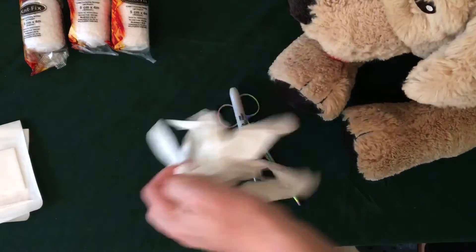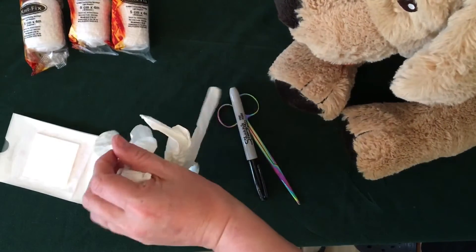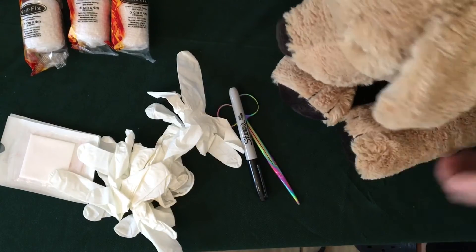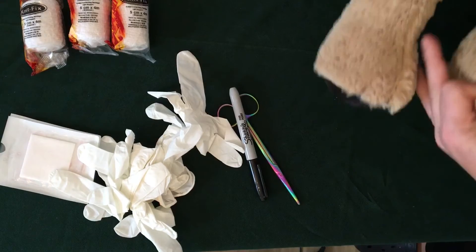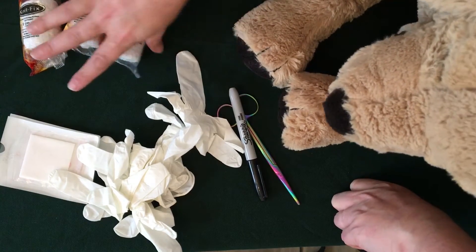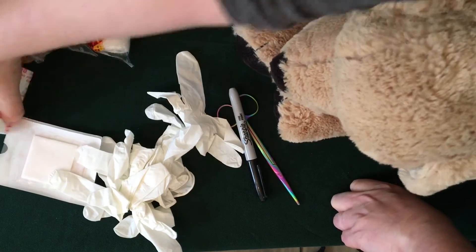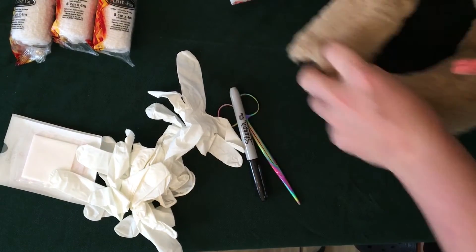Gloves, because we're going to need that for when we are handling our dressings. So a couple of things before we start. You're going to have a reasonably long legged dog. So my recommendation is ignore the five centimetre, just forget it exists and get your seven or your seven and a half centimetre, whichever brand they are using.